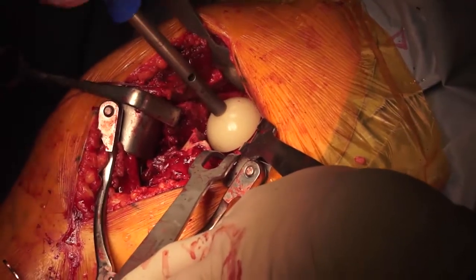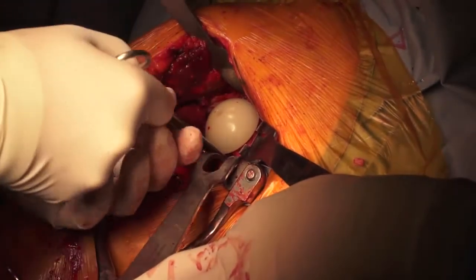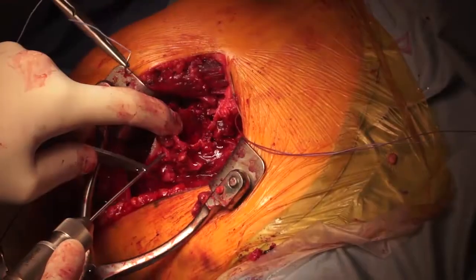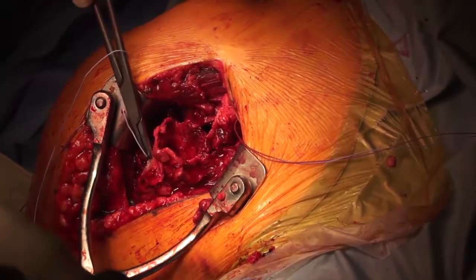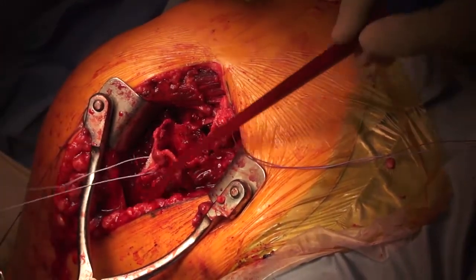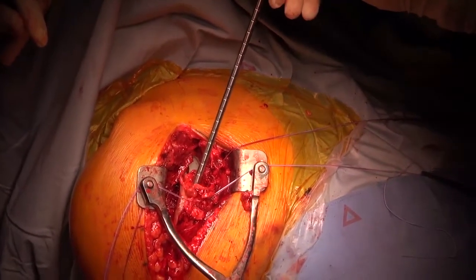The polyethylene glenosphere is snapped into place against the base plate and checked for stability. The fixation screw is inserted. Four holes are drilled in the humeral shaft to accept two non-resorbable sutures. The cement restrictor plug size is determined.